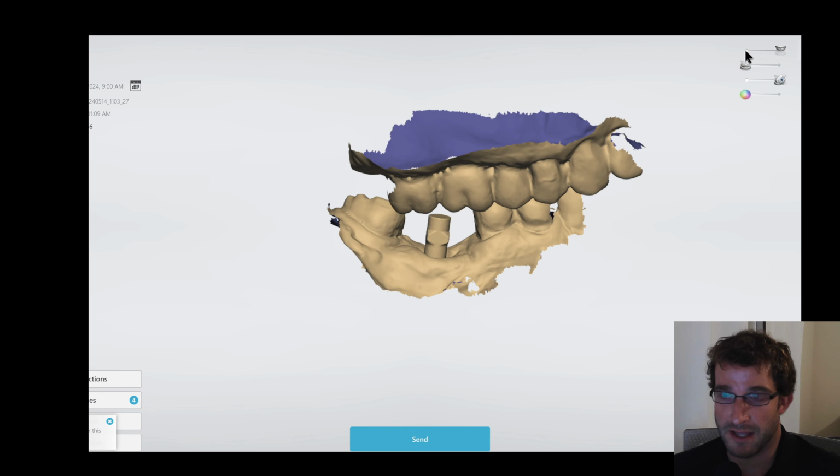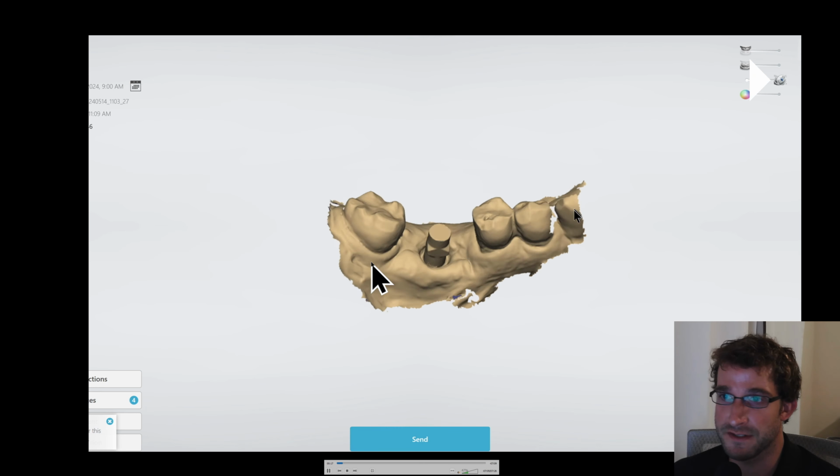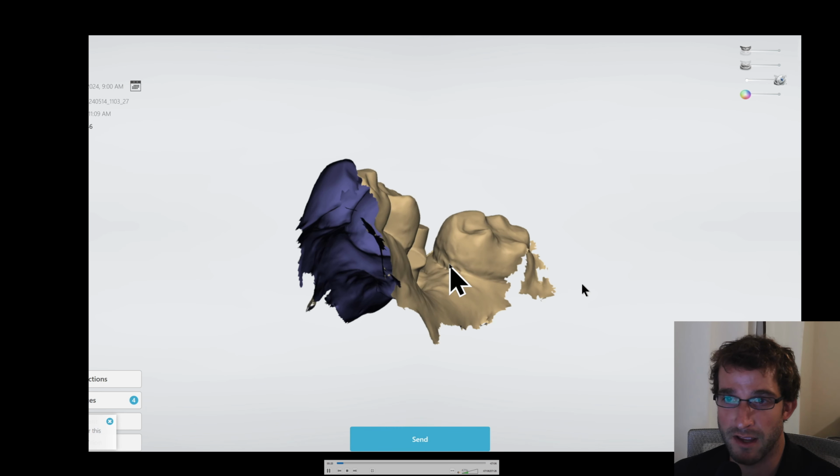Basically, the case is going to start from the point of having the sintered milled crown, and then we're going to bond the tie base and then install it. So this is the scan, and I'm going to leave it there.